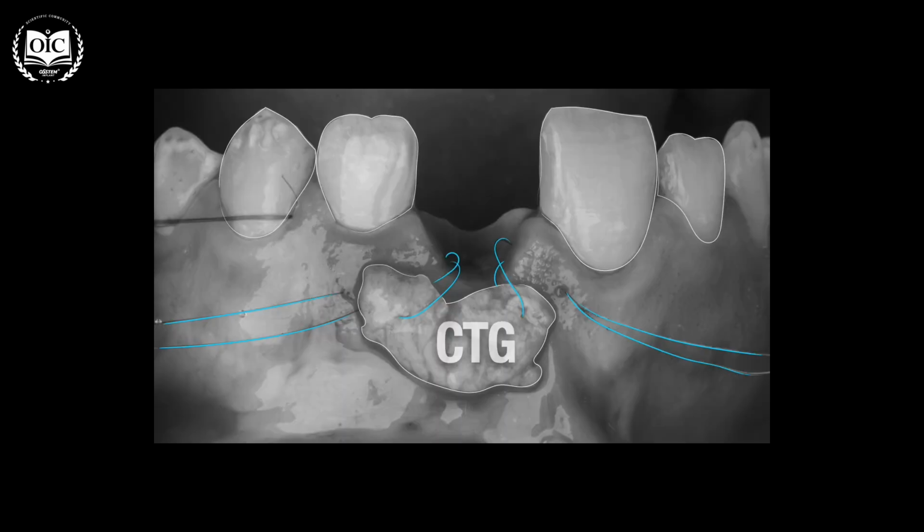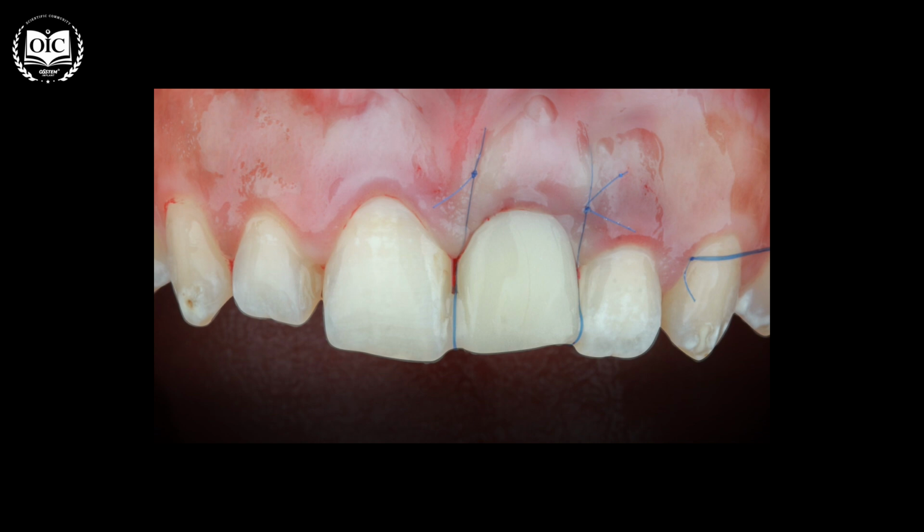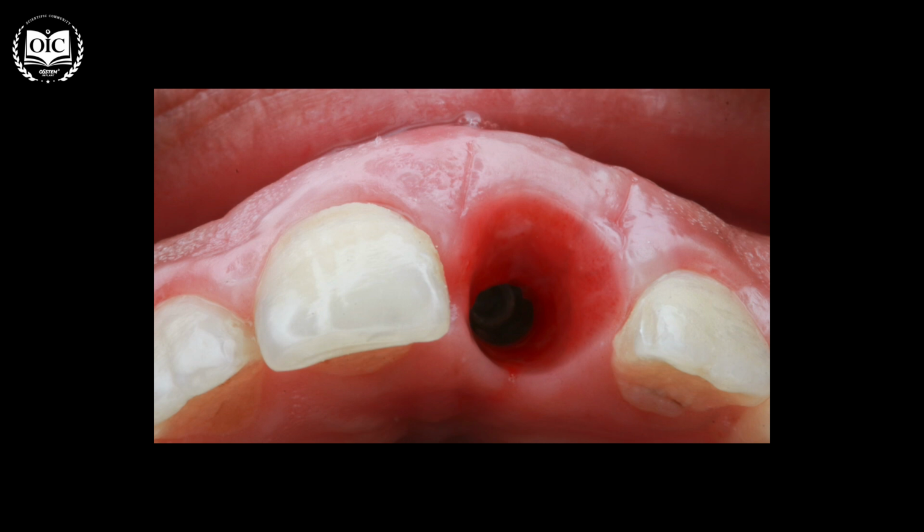On the same day of the connective tissue graft, we have to put back the crown in place and start to pull the tissues over the contour of the crown that has been designed in the software to guide the tissue healing in identical form and shape to the adjacent tooth. The central is done with a crest of contour that matches the contralateral central for the tissues to follow the same curve as the other central. So it heals beautifully after 2 weeks.